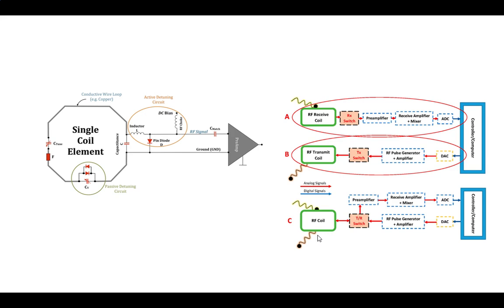I'm presuming most people have had some electronics courses, so you feel comfortable with multi-stage amplifiers. That's really important because you're going to have different frequencies. The signals are weak, so you really need something that's almost a follower at first, just to get you a strong signal, maybe a small amount of amplification. But then you move into the later stages.